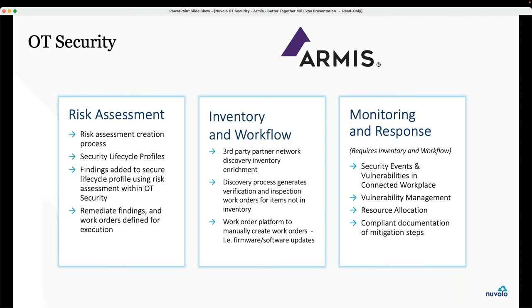But to your earlier question, definitely look at this. If you haven't seen it, there's quite a bit of publications. The granddaddy of them all is 800-53, which you're all familiar with, or you should be. But I'll recommend what I call the Cliff Notes version of that. It's 800-213. When you first see it, it says IoT devices and government and federal agencies. Ignore that, but still go through it, and you'll see that about 80 to 90% of those controls are applicable to medical devices as you do a full assessment. So. Go ahead. I don't want to take any more time from the demo.